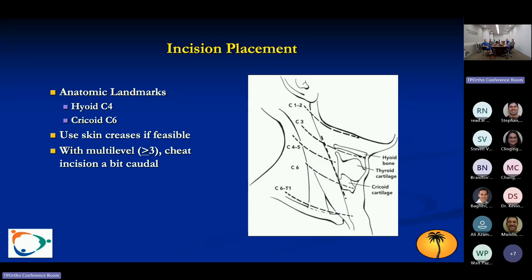Sometimes it's hard to get your arms around it until you see it work. But you'll see in lateral surgery, we do the same thing with deformities or multi-levels. We'll start at the top and push the spine away. And then that allows you to go through a single incision that's a little lower.